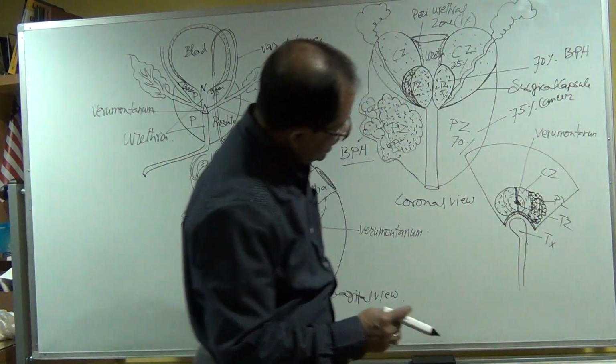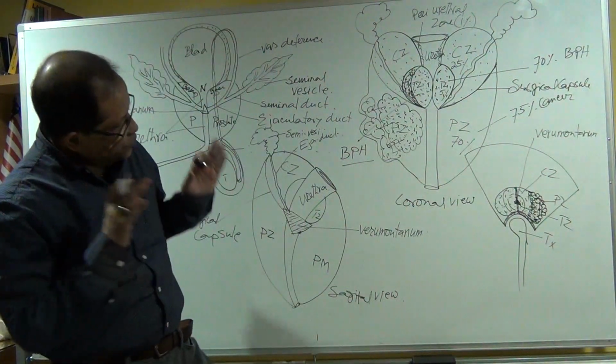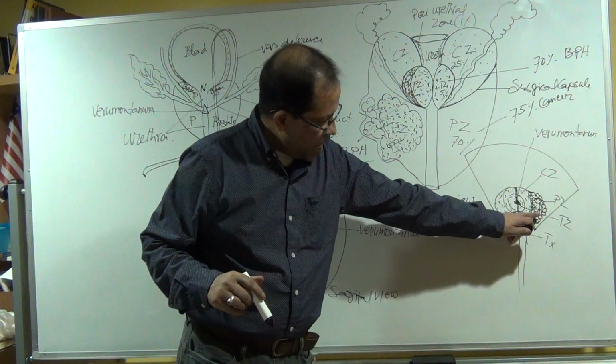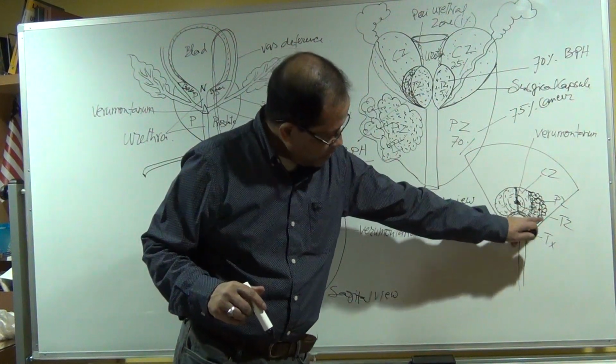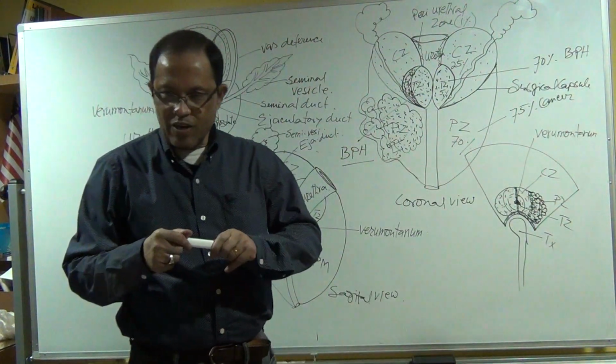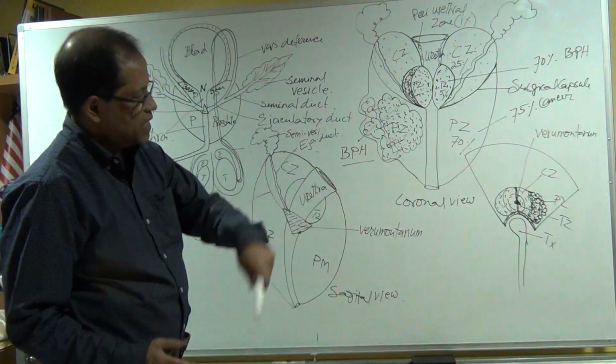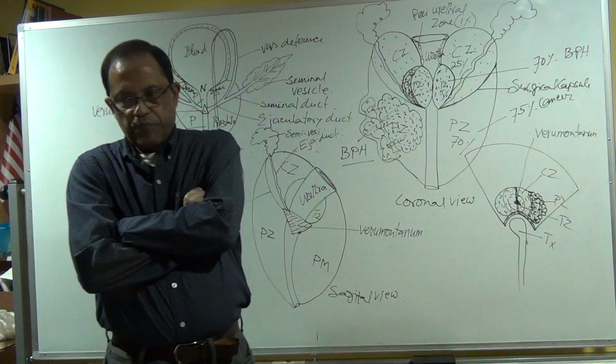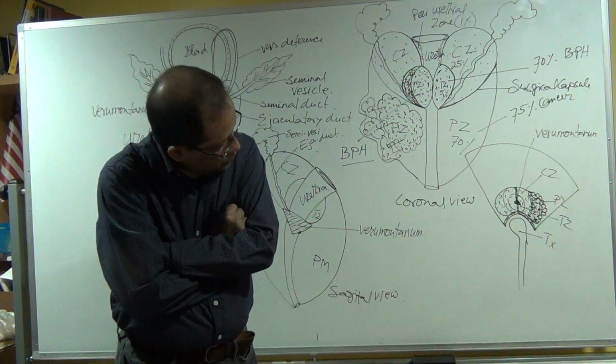So then what you're going to see if there's a mass in the peripheral zone? You will see the borders are irregular, something is pushing the outer wall, and it is hypoechoic, sometimes heterogeneous. Then you will say, oh, I got it. So that is malignancy. But most of the time it is asymptomatic.